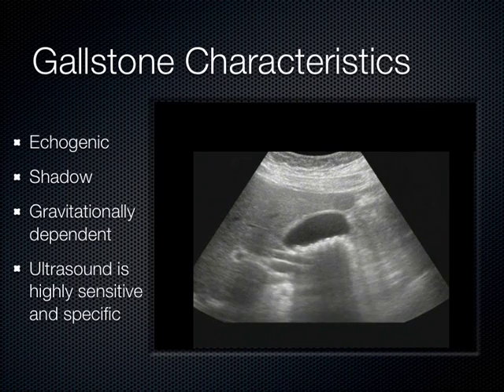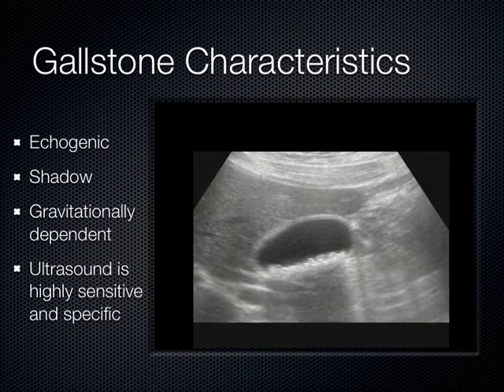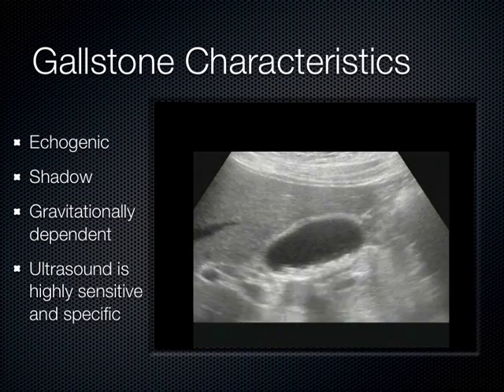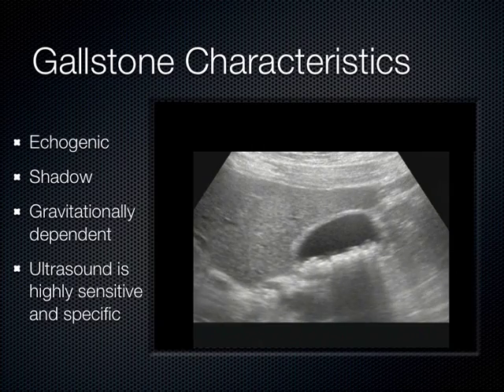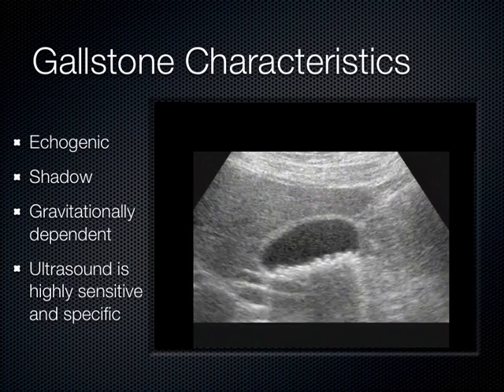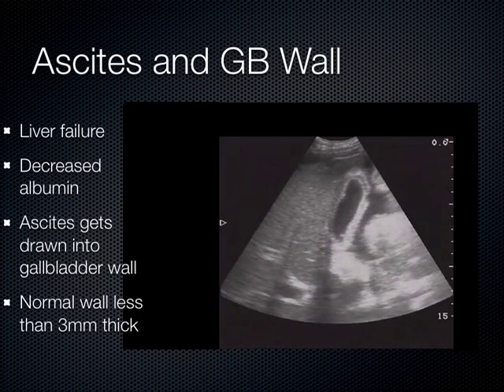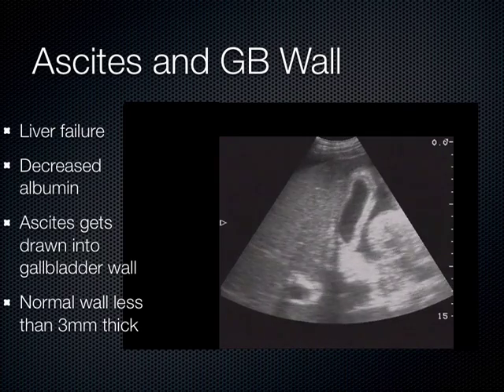It beats out CAT scan because with a CAT scan, you can miss on that one little cut, you miss the gallstone. And I've got plenty of examples of that from the literature and anecdotally, where ultrasound found stuff that the CAT scan missed, especially when it comes to gallstones. And this is just another example here of the gallbladder wall.